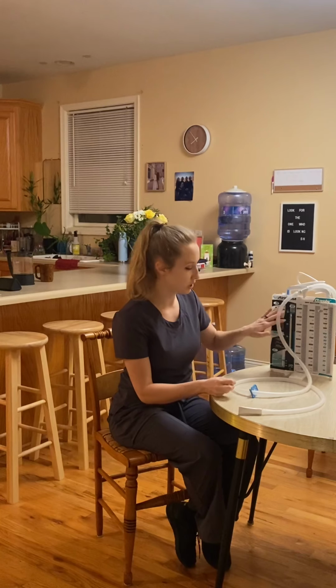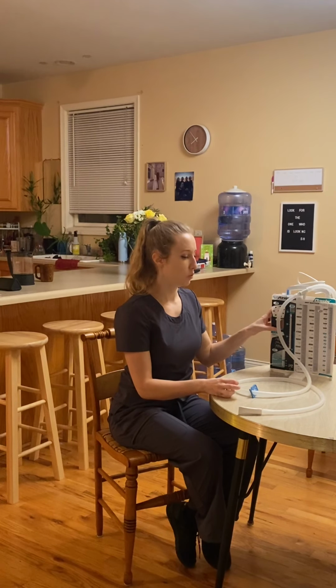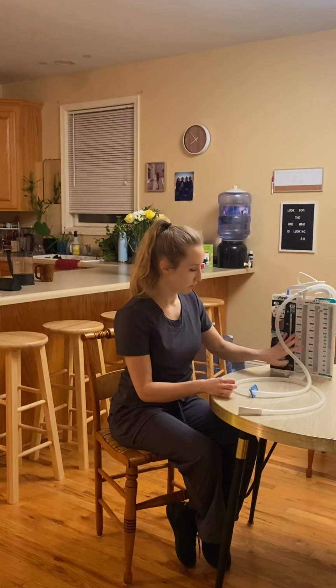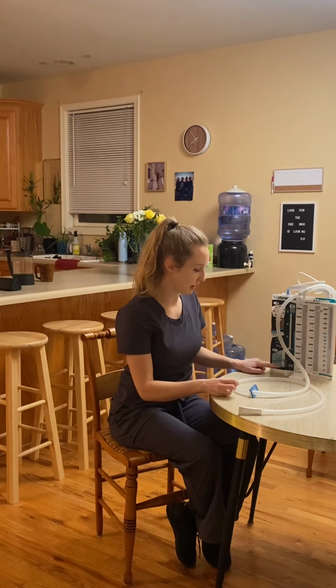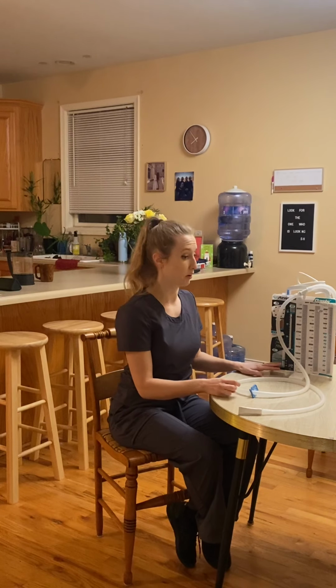This suction, you have a dry suction, and so we can monitor the amount of suction going on there. And then we also don't want to see bubbling because the air leak can be an emergency, and I would need to let the provider know right away if we did see that.